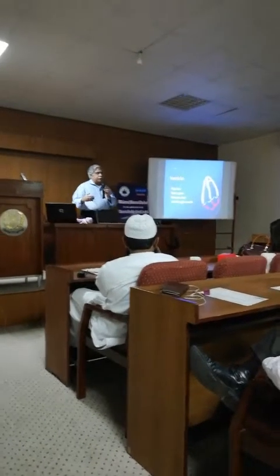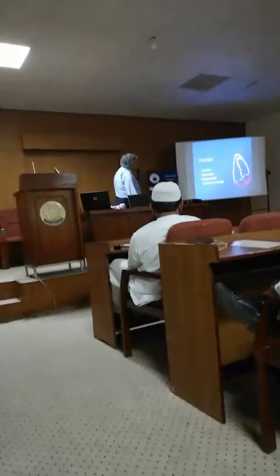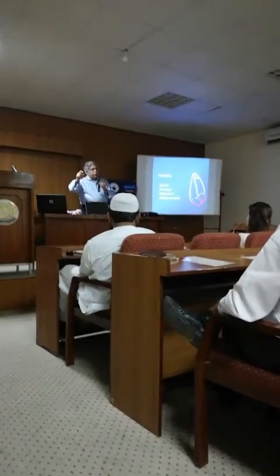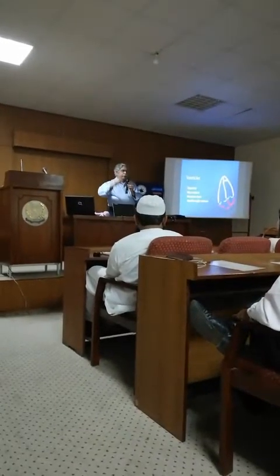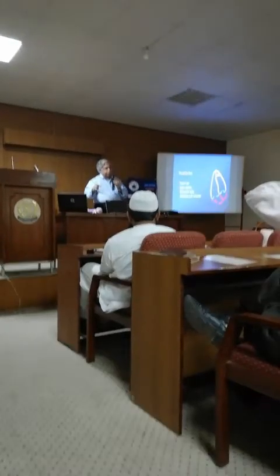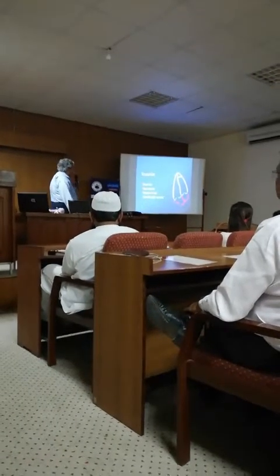Ventricles should be of approximately the same size, although the right ventricle can be slightly bigger than the left ventricle. The septum needs to be intact. You have this echogenic muscular bar in the lower part of the right ventricle, and that is one of the distinguishing features of the right ventricle from the left ventricle. When the heart is displaced and you want to look at the right ventricle, the moderator band helps you to decide whether this is the right ventricle or the left ventricle.